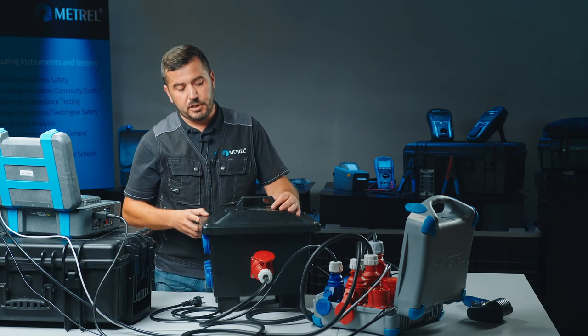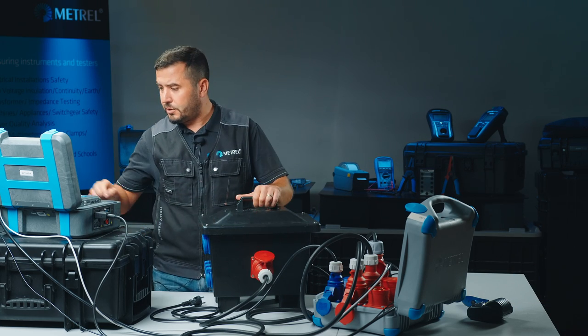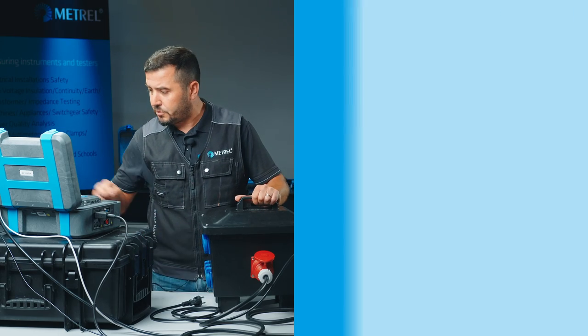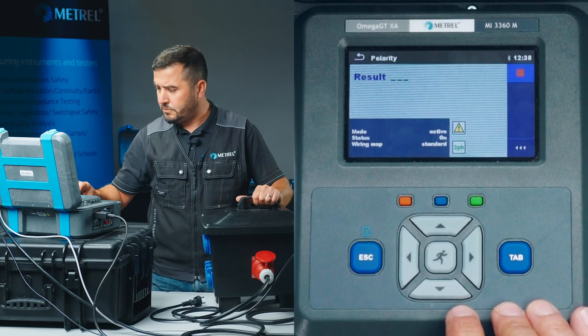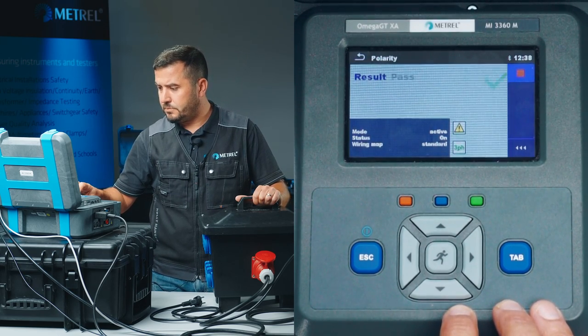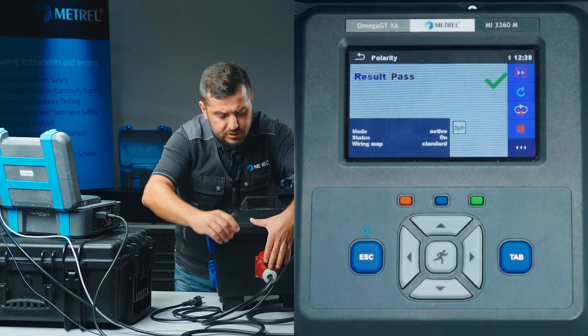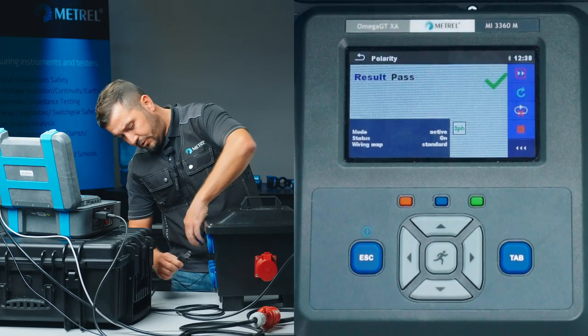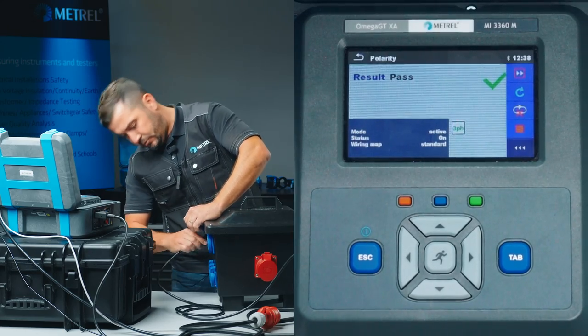Again, we will start evaluating the three-phase socket and then proceed with evaluation of the rest of the single-phase sockets. The first test has passed. We disconnect and reconnect our test cable to continue testing the remaining outlets.